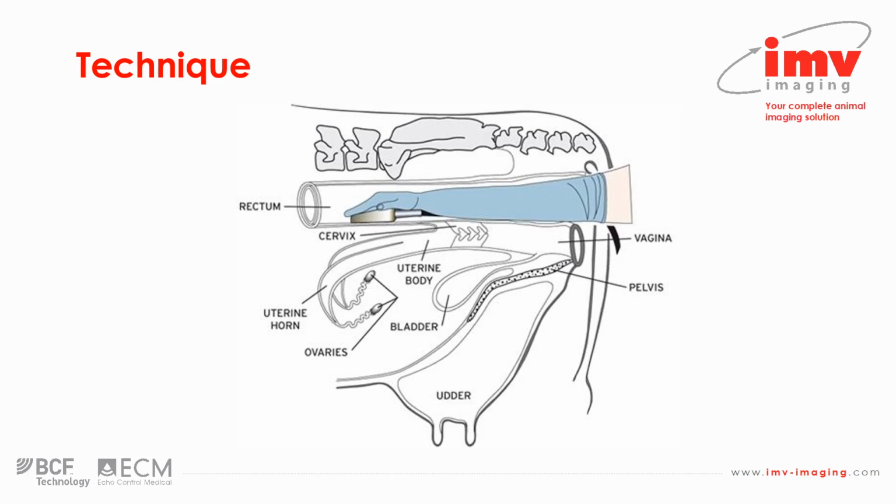Once we've done that and we've got our arm in, usually to around about the elbow or just before, depending on the size of the technician or veterinarian, we can then cup the probe in our hand as shown in this picture, usually gently pinching the probe between the thumb and either third or fourth finger, depending on your preference, with your second or middle finger, so index or middle finger, sitting on top of the probe, and in most cases there will be a ridge or a concavity in the top of the probe that gives you an indication of which way up the probe is and whether you have it in the correct orientation.